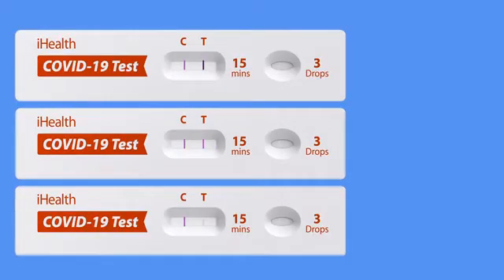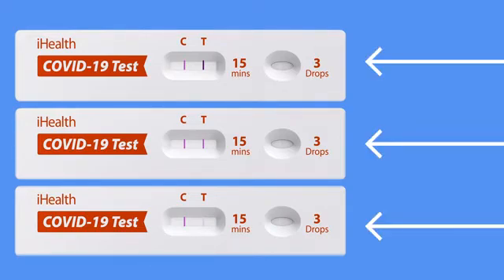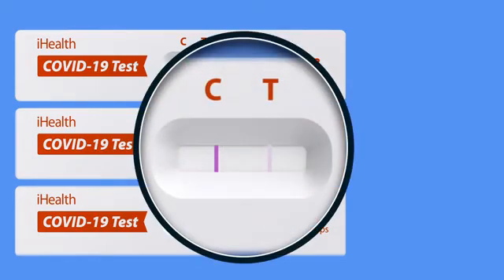Nice! But be aware that depending on certain factors, such as how long the virus has been in your system, the line under the T may be very faint, regardless of how light or dark. Any line at all under the T means that you have tested positive for the virus. If you're unsure, you may wish to use a magnifying glass or hold the test card under a bright light for closer inspection. And that's it.